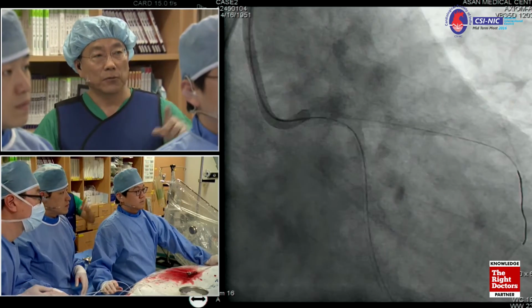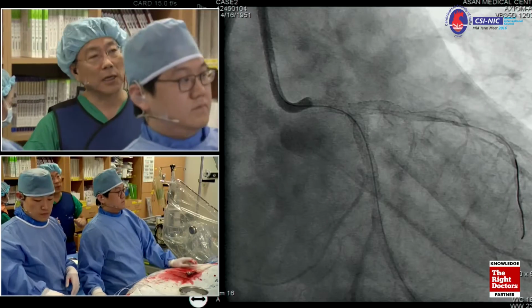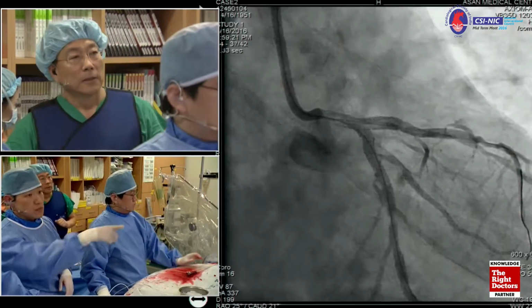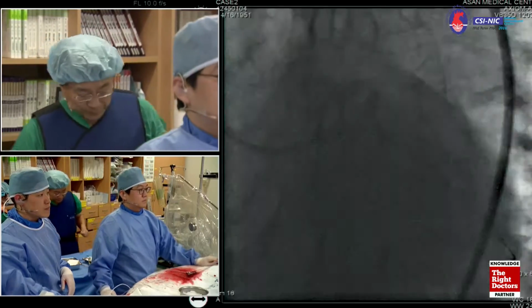However, okay, perfect. I like this one, right? Why not spider view, right? That's great result. We really enjoyed the 2 cases, and they were very educational.